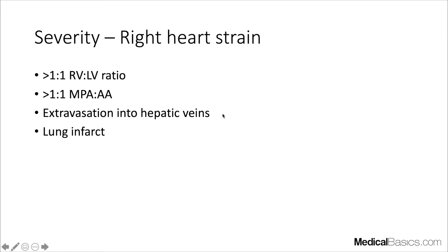When we talk about right heart strain, it's typically diagnosed on echo or CT. It relates to strain put on the right side of the heart. Normally the left ventricle should always be bigger than the right ventricle because the LV has to pump blood to the rest of the body. When the RV is bigger than the LV, you may suspect right heart strain. Another sign is the interventricular septum bowing toward the left ventricle instead of its normal rightward orientation.